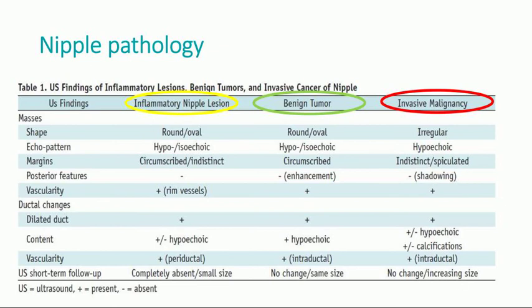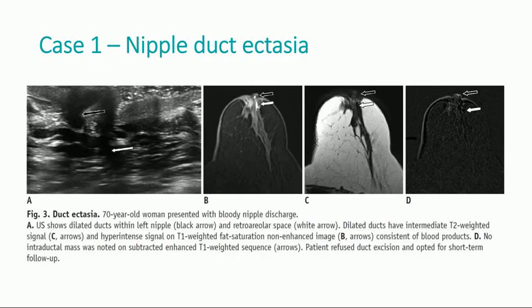I will now exemplify with cases selected from the paper. Case number one: nipple duct ectasia in a patient presented with bloody nipple discharge. Ultrasound shows dilated ducts within the left nipple and the retroareolar space. The dilated ducts have a hyper-intense signal on T1-weighted fat saturation non-enhanced image, consistent with blood products.